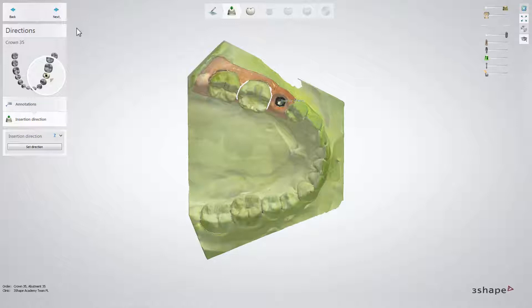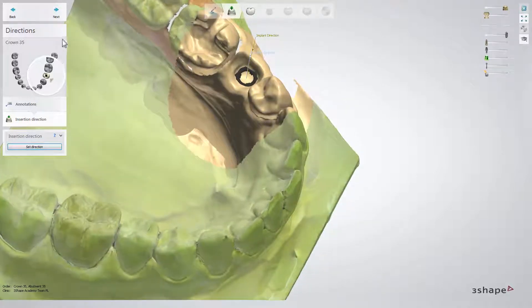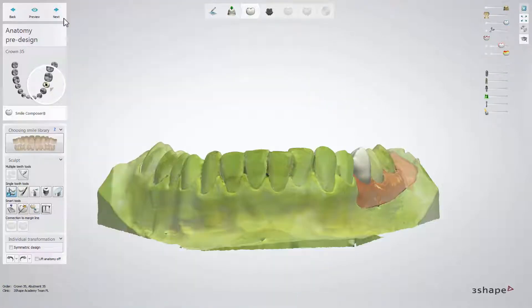Once you have annotated the implant, it is necessary to specify the insertion direction. You cannot change the direction of the implant, but it is possible to change the insertion direction of a restoration that goes on top. Find the optimal insertion direction by positioning the scan in the design window from your occlusal view. When the desired position is found, click the Set Direction button to save its position and click Next to go further in the design process.